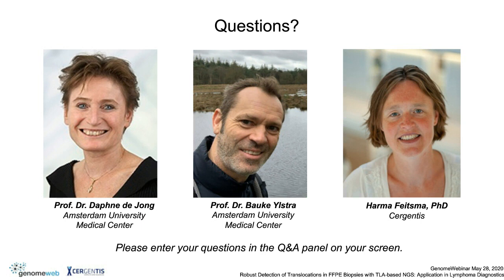Great. And the next question in here is for Bauke. Can copy number variance detection also be included in the TLA assay? Yeah, I briefly alluded to that already in my talk. So yeah, it's just a matter of putting a copy number probe. So you just put probes genome-wide, like let's say every half megabase or something. That would be one approach.